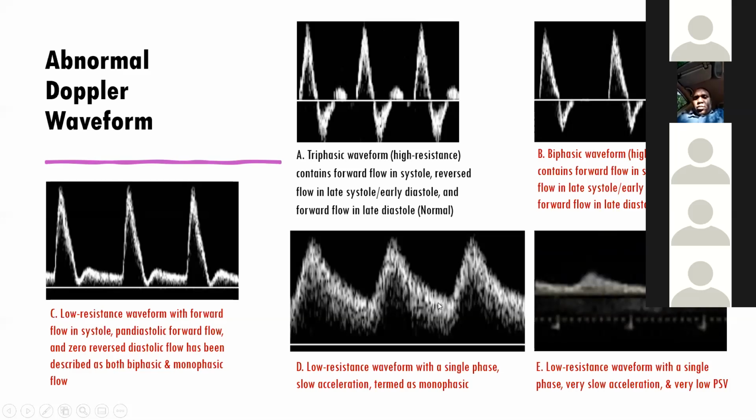So you should check how you will trace this blood vessel and go up and you will get a narrow part of the blood vessel, and you place your color Doppler and spectral Doppler, and I am showing you later on how we can diagnose the disease. So in this way you can identify the stenotic part. This is very important to find out that part because this patient will need treatment.